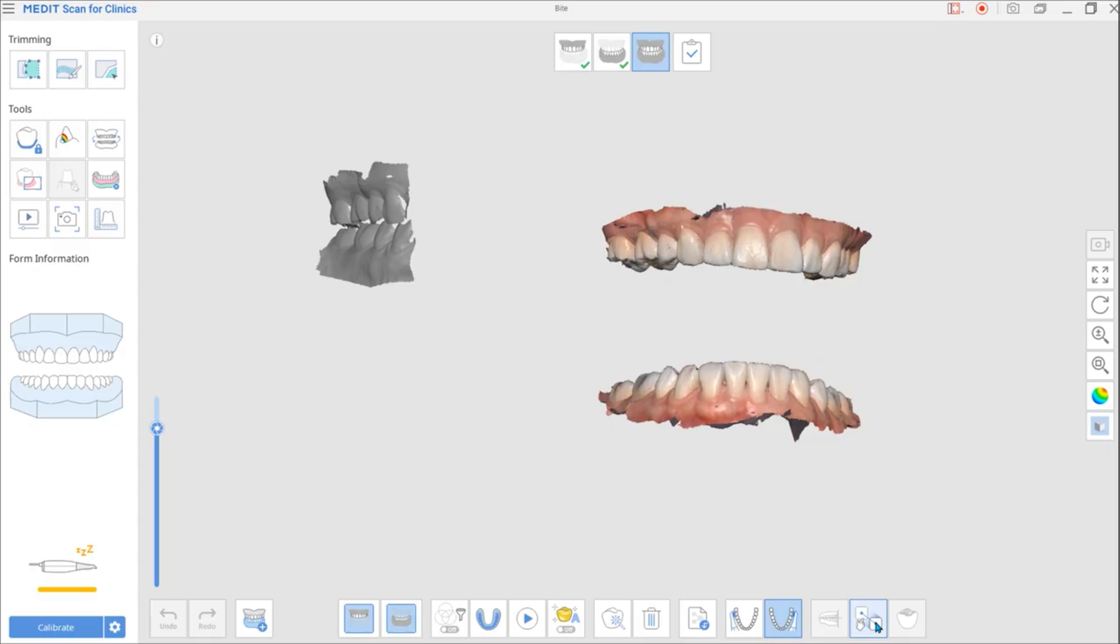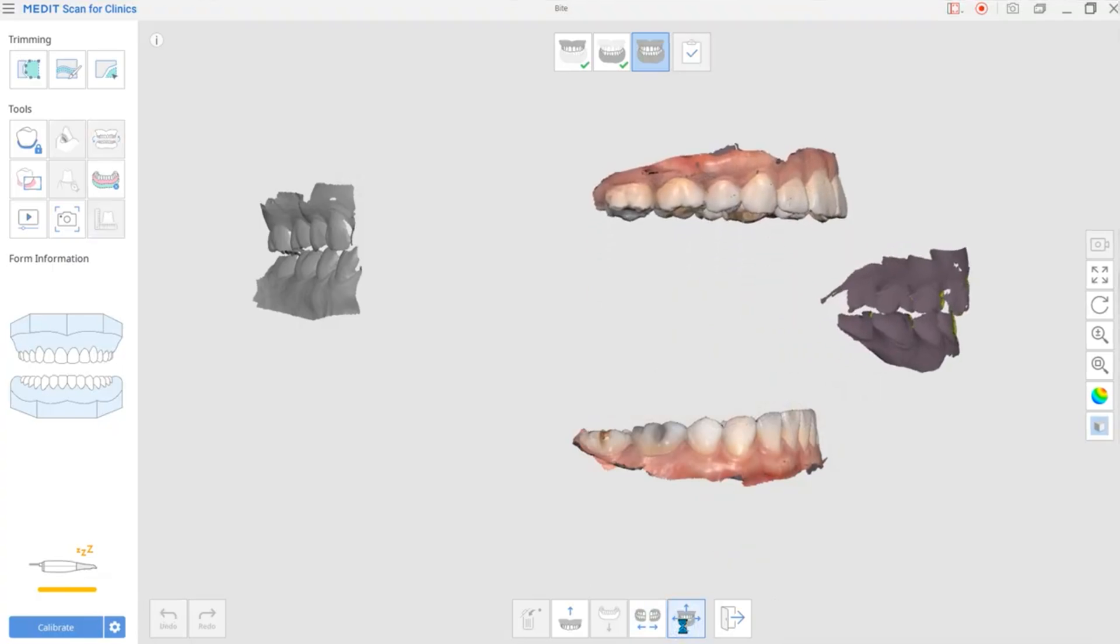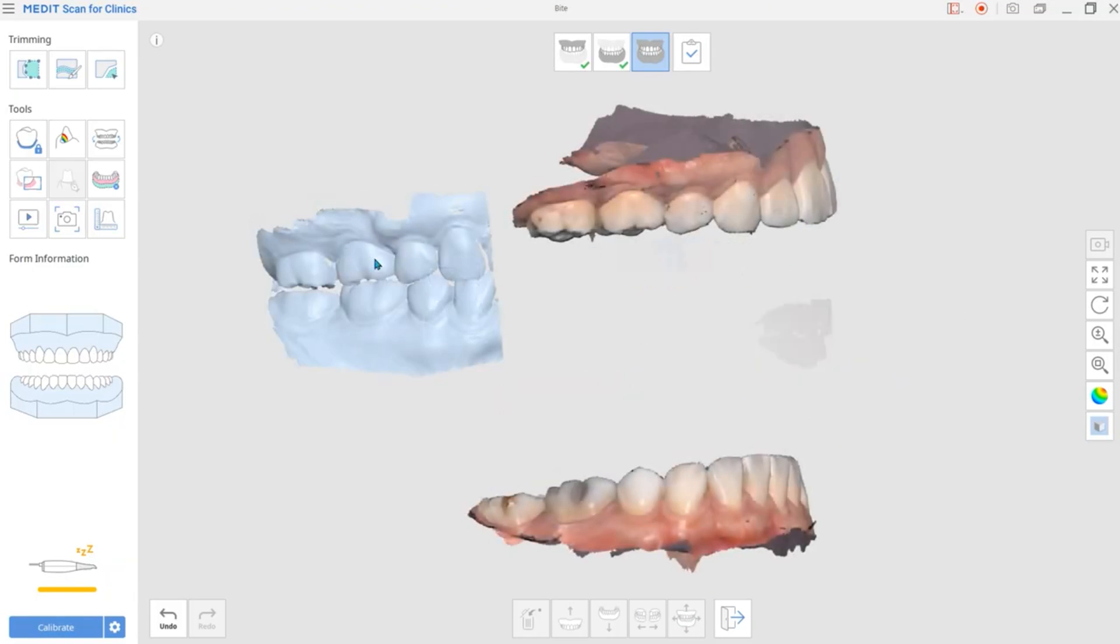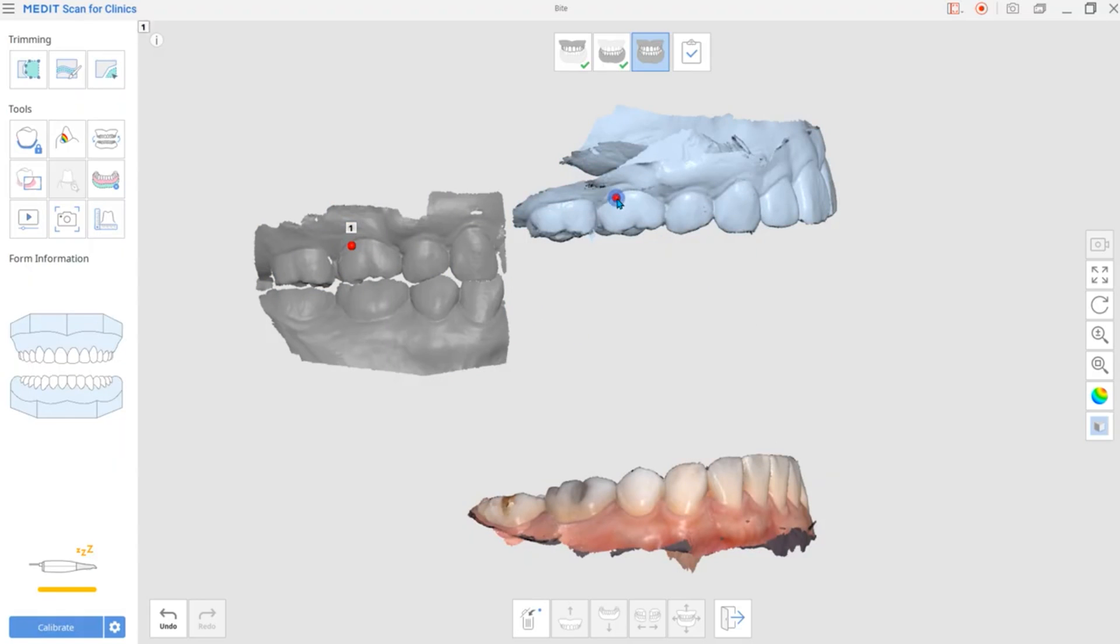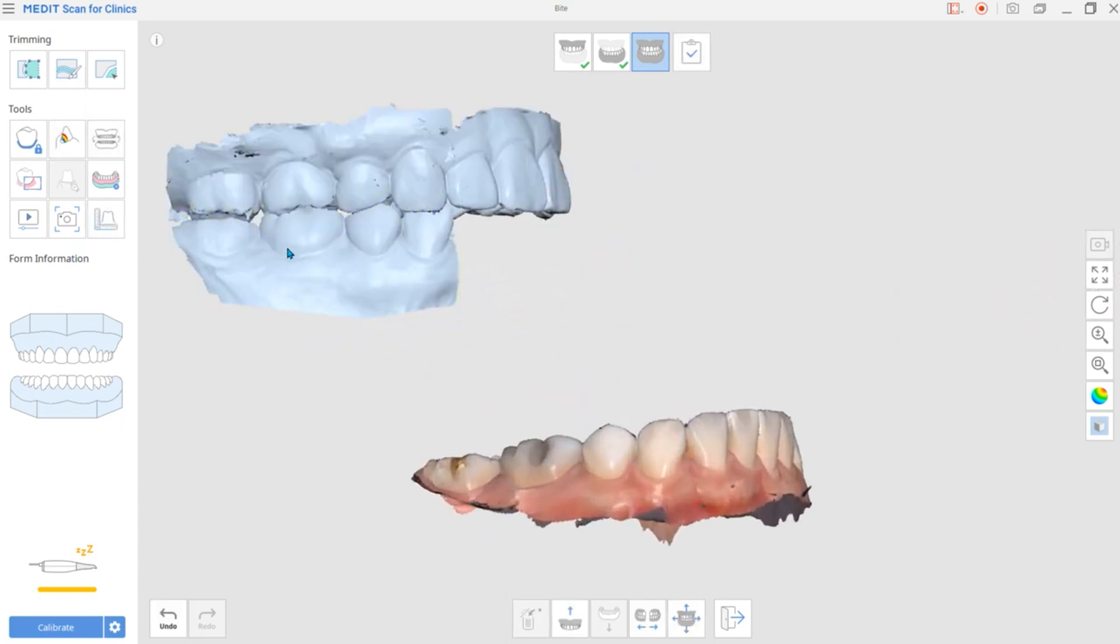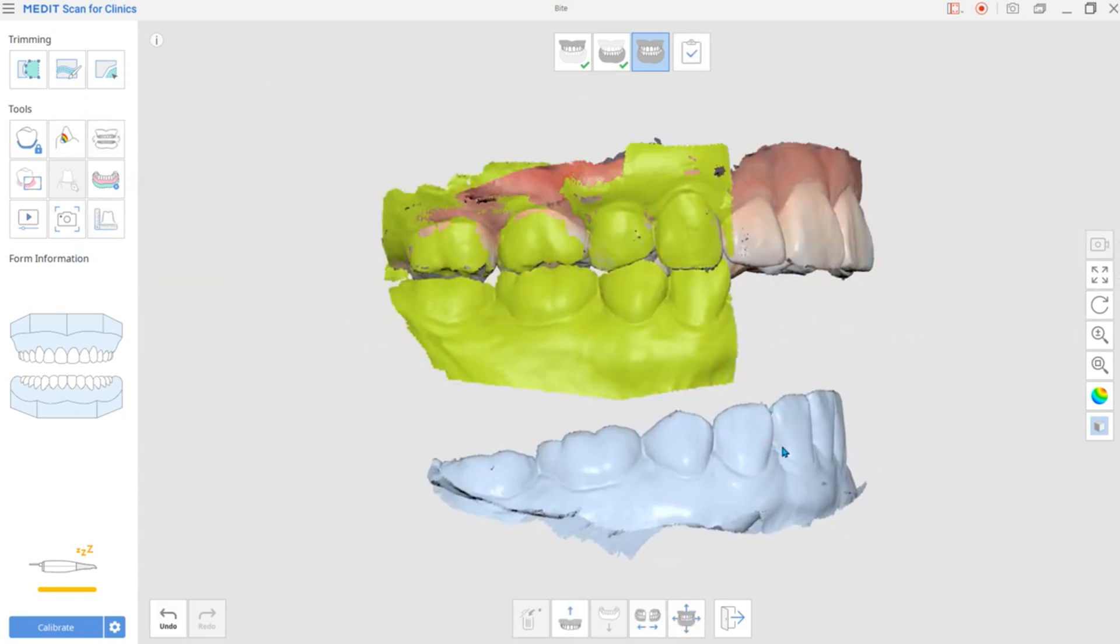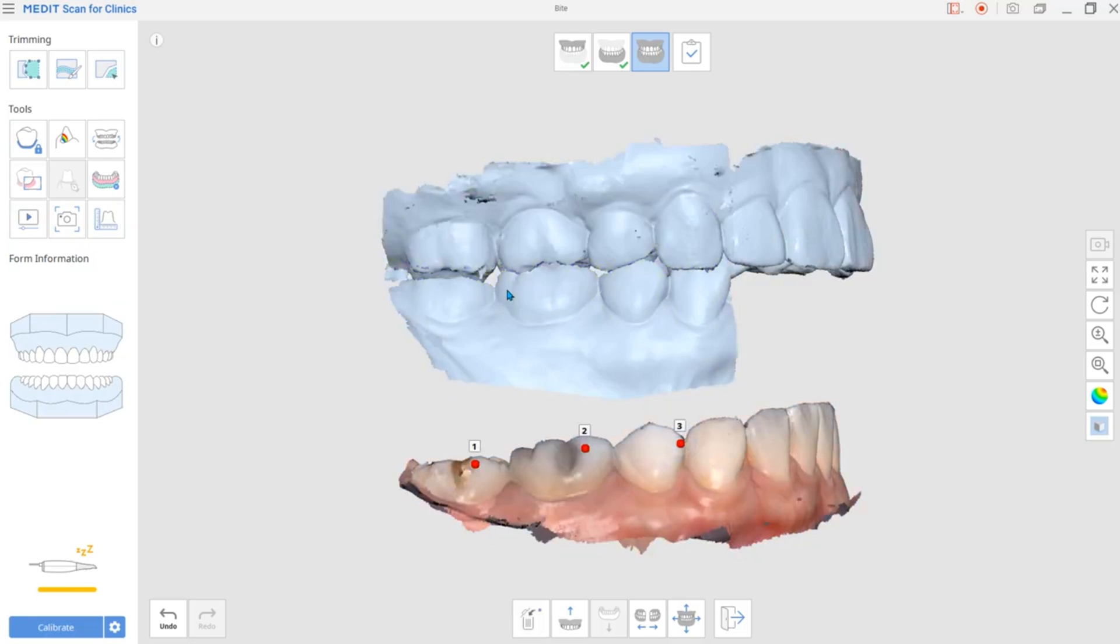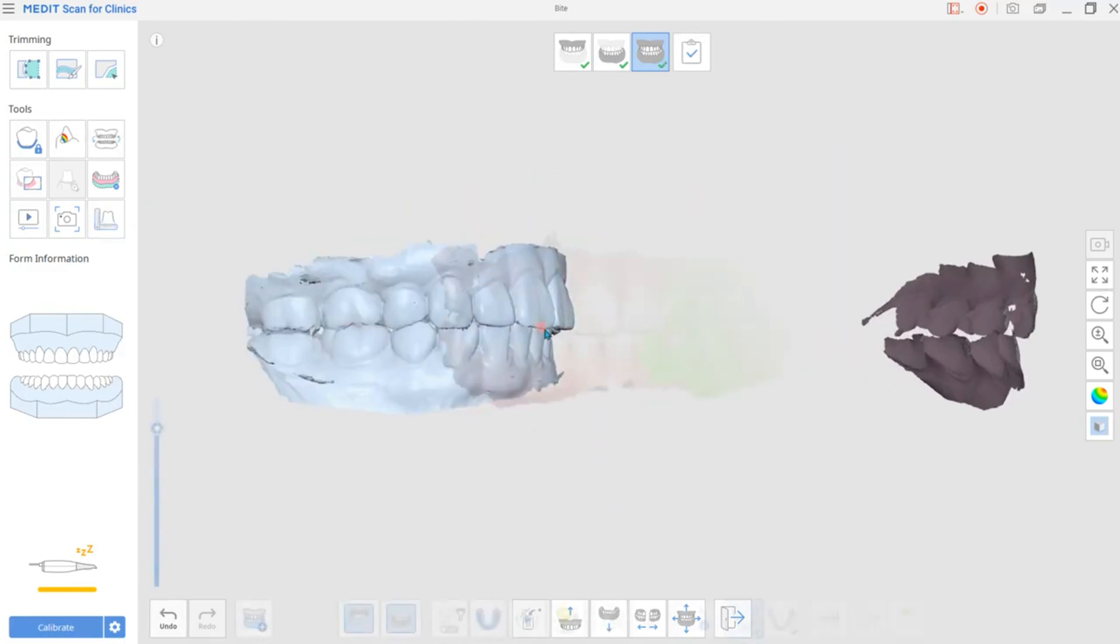In this case, you can complete the occlusal alignment with the manual alignment. In the occlusion scan stage, enable Manual Alignment. Place the matching points on the arch and the occlusal scan data. In general, one or three matching points are enough for the alignment.